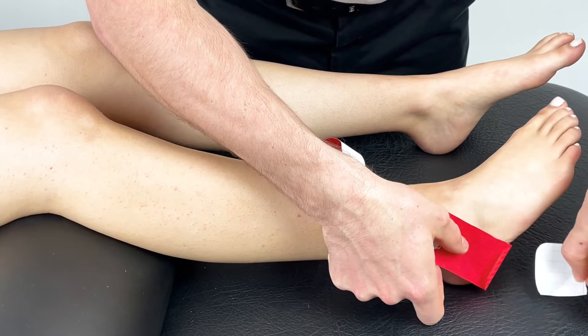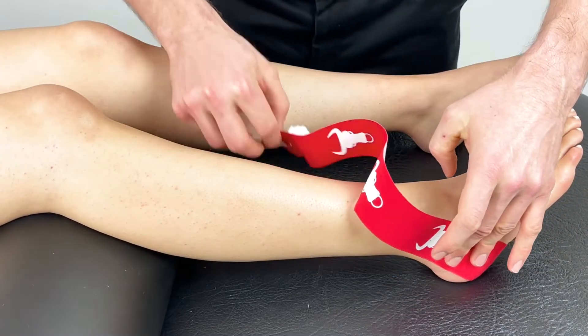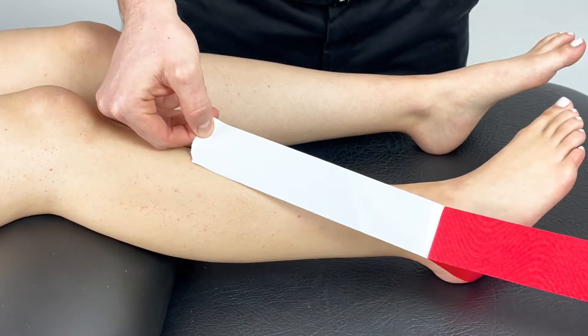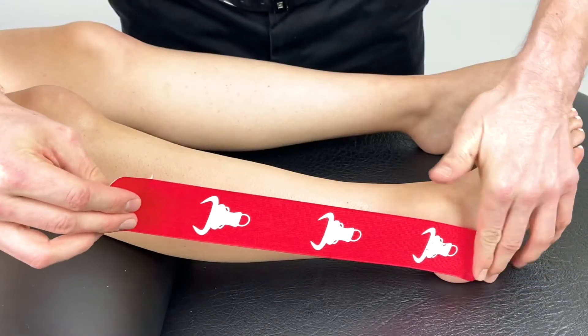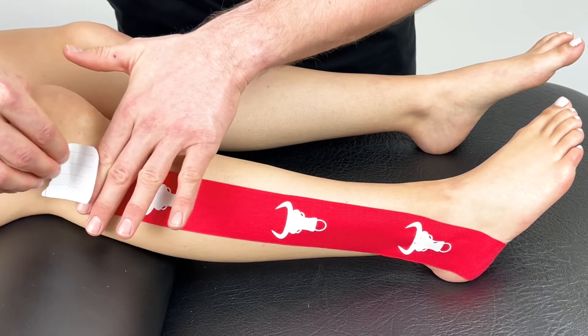Anchor just here on the heel, remove the backing strip and apply with mild tension toward the fibular head, ensuring the anchor is placed down with no tension.